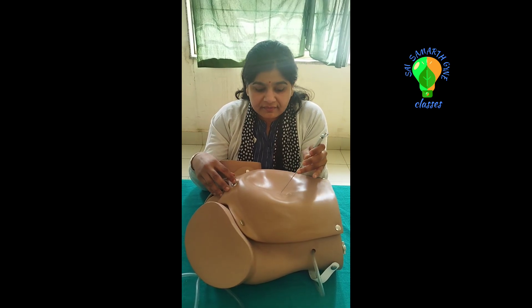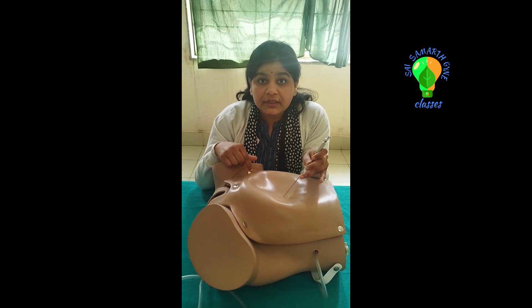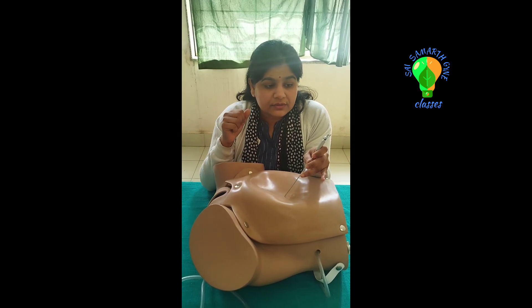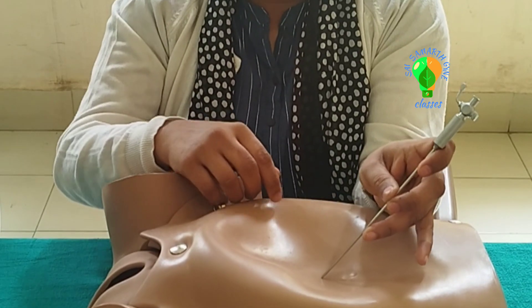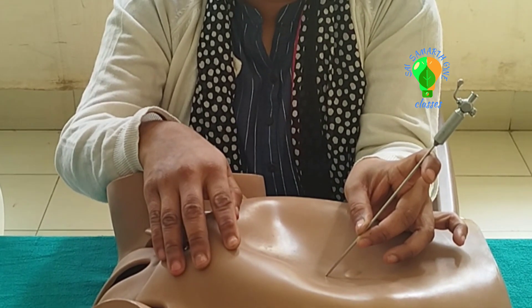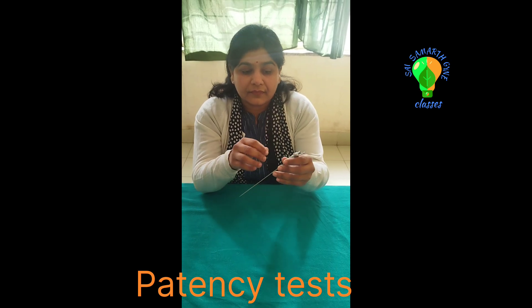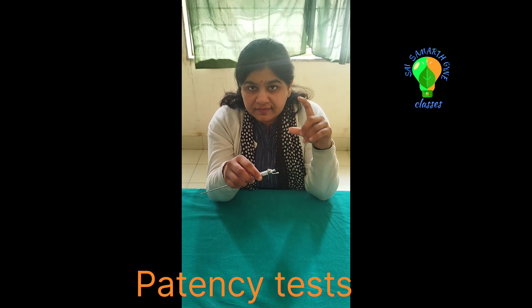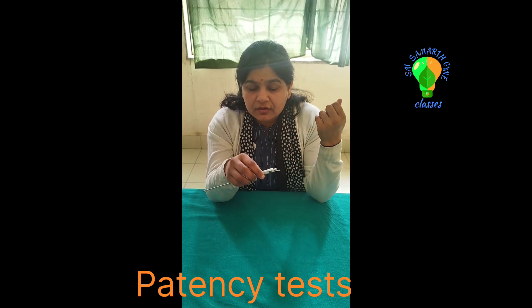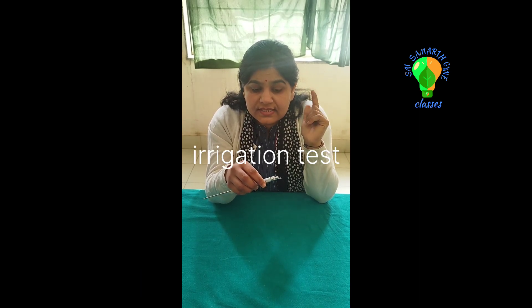Now you have reached the peritoneal cavity. How to confirm that you are inside the peritoneum and not in a closed space like the bladder or bowel? Ask your assistant to hold the Veress Needle in position without displacing it, then perform certain tests. Take a 5cc syringe filled with normal saline, connect it, and check for free flow of saline. This is called the irrigation test — the saline should go in freely.